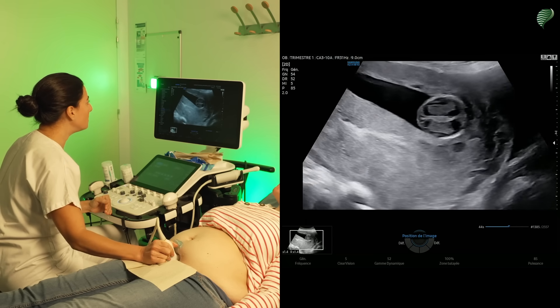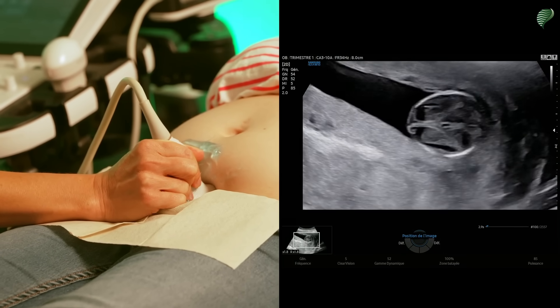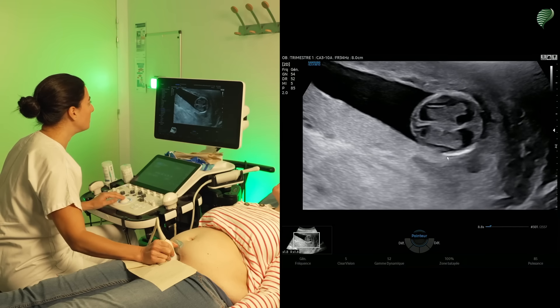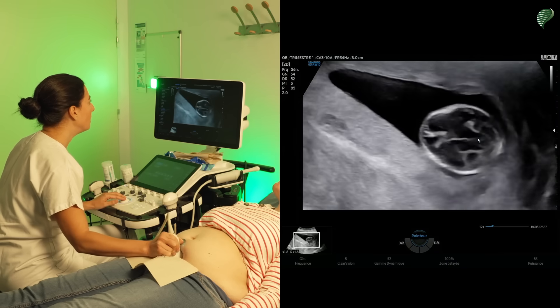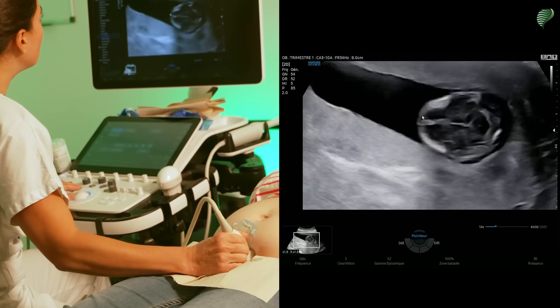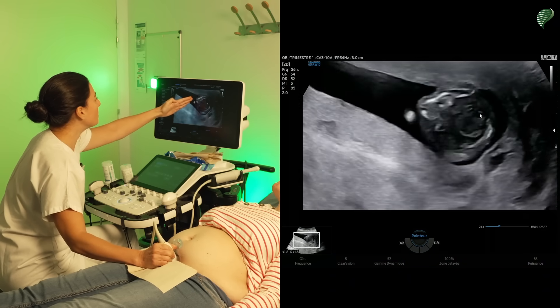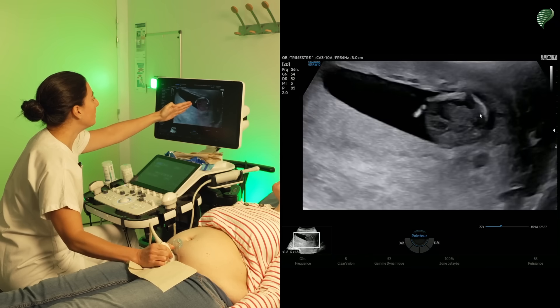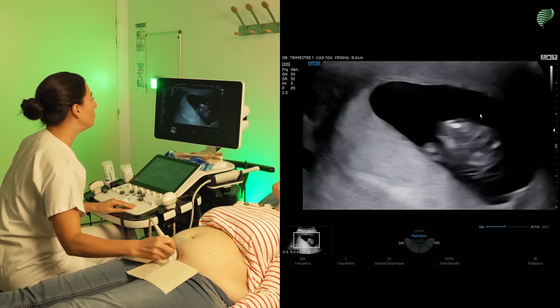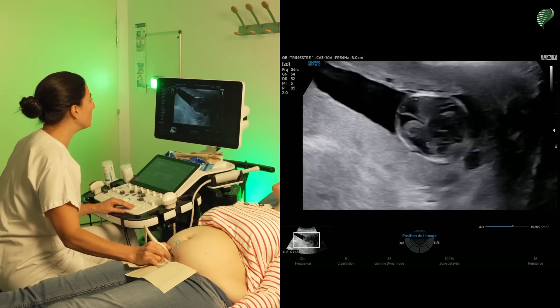I'm at the level of the cephalic pole and performing a transverse section. I can explore the contours of the calvarium — the bony skull contours are well defined. I can adjust the depth to see the front or back better, since everything on the tangential part of the ultrasound beam will be a little more difficult to explore. Hence the interest in rotating the probe to visualize the entirety of the calvarium contours. I make sure to always stay centered to ensure an optimal image.